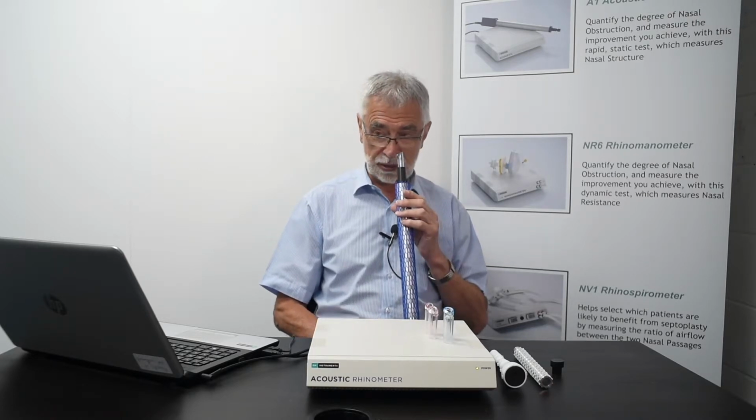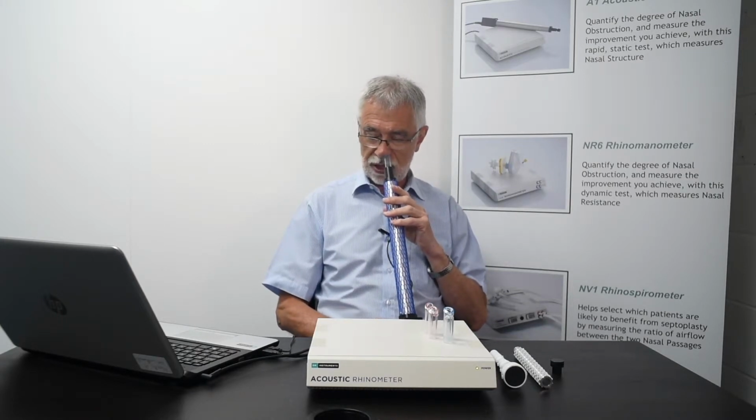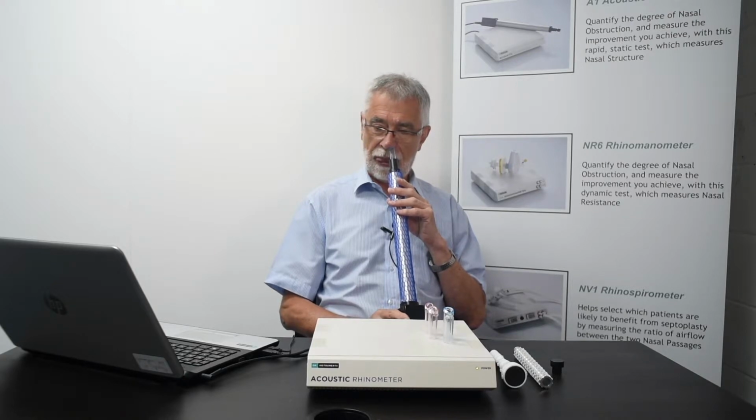But first of all we need to apply the nose piece, and normally I would suggest that you help the subject position it so that it looks as if it's sealing without distorting the nose too much. Normally I would then ask them to take a couple of breaths in and out through the nose so that they can feel whether there's any leakage there. And typically if there is leakage, the subject will be able to feel that and tell you, and then you could perhaps reposition the nose piece.